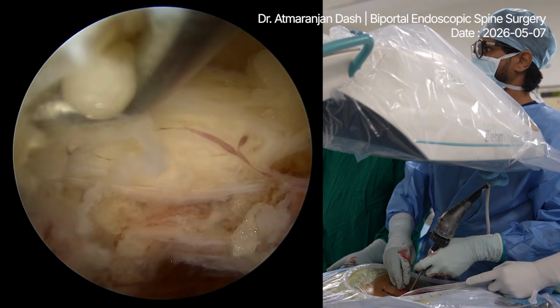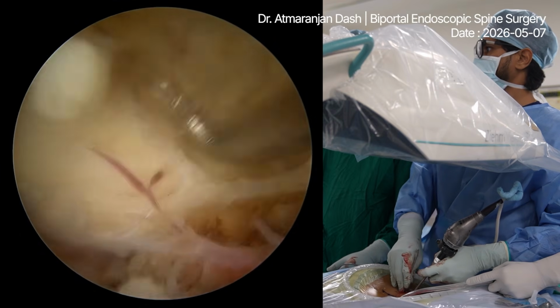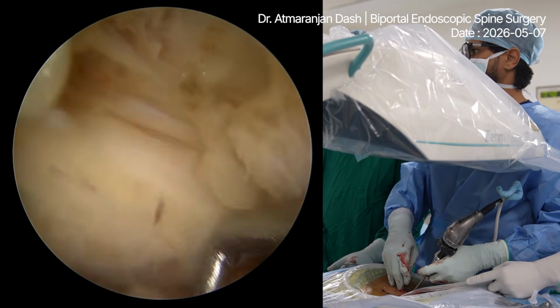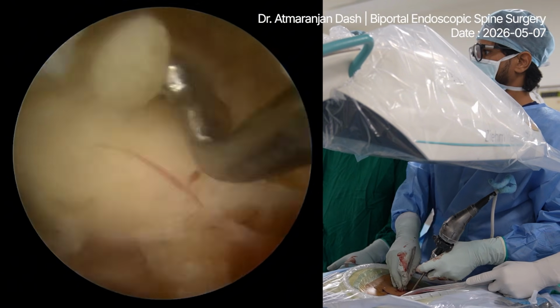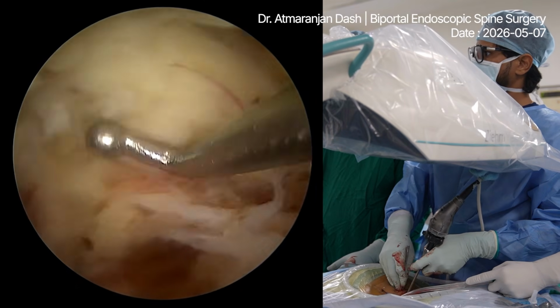Now we see the root and we will do some foraminal work now. This looks like a root because it is thick.